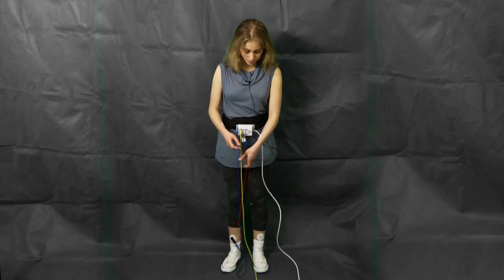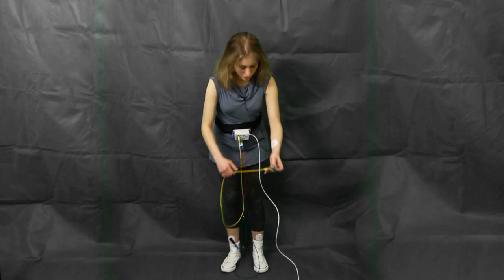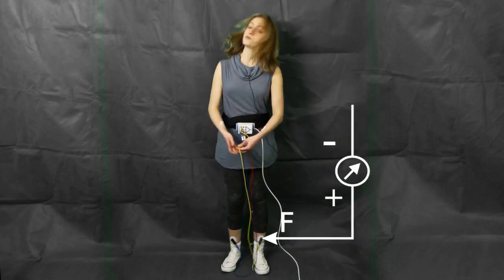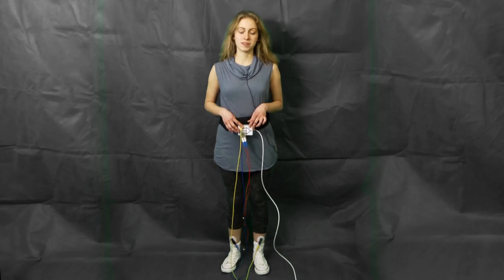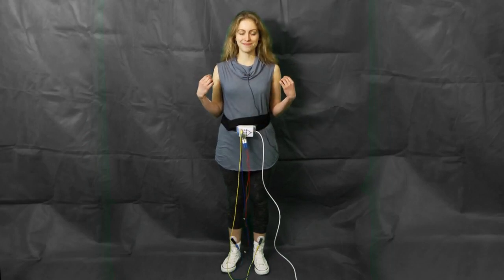For the foot, we have got the foot electrode, which I'm just going to place down here. And this one is connected to the positive input of the amplifier. So this is the easy part. But now comes a trick for the electrode between my shoulders.